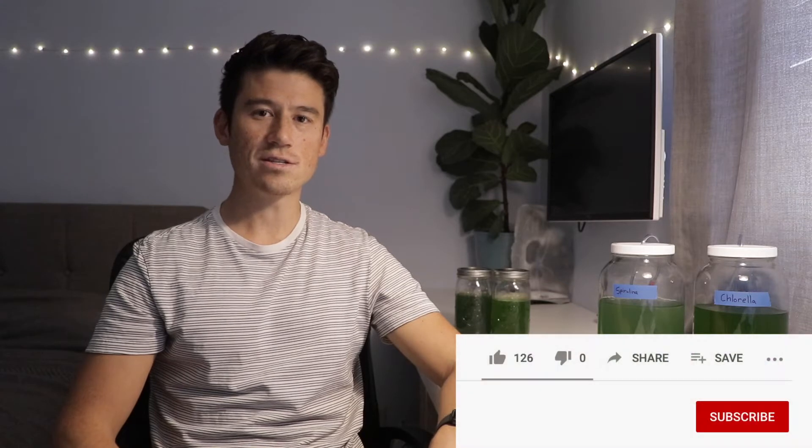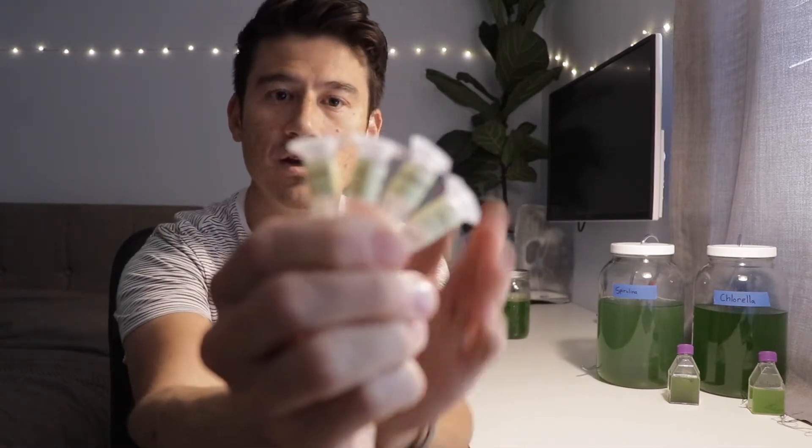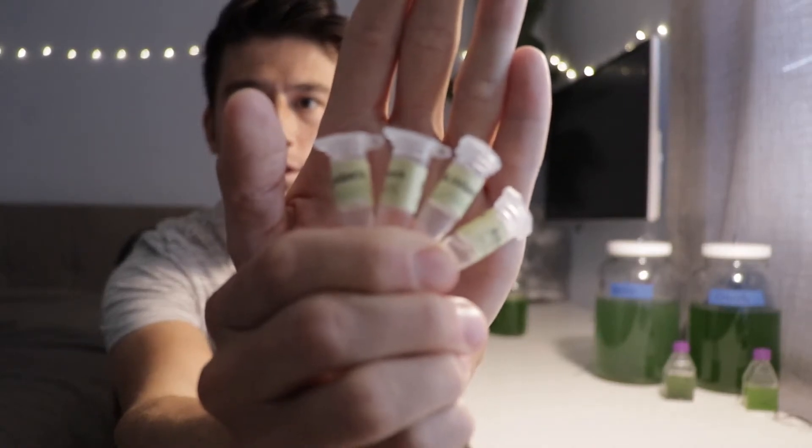First I wanted to tell you how my algae is growing after 46 days. This is probably one of my last algae growth check-in videos I'll be doing, because I've gone from four milliliters — I had these four one-milliliter centrifuge tubes that I started with — and that's now expanded to 6,500 milliliters.